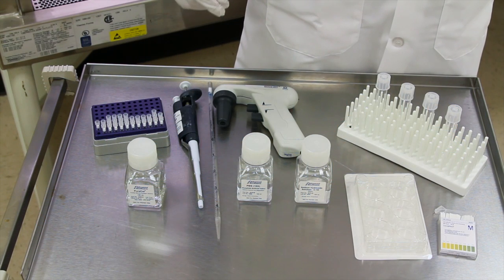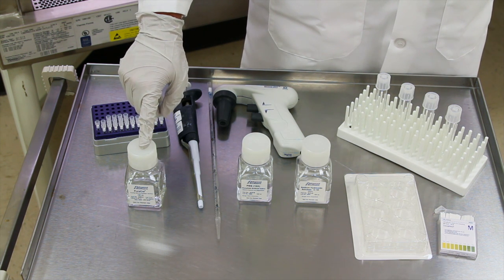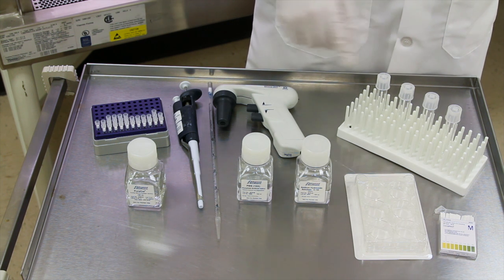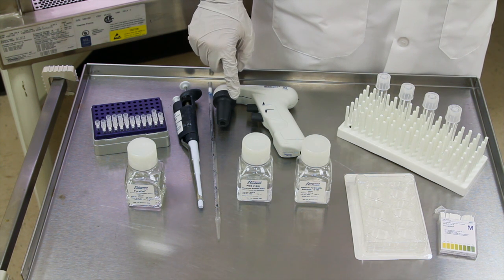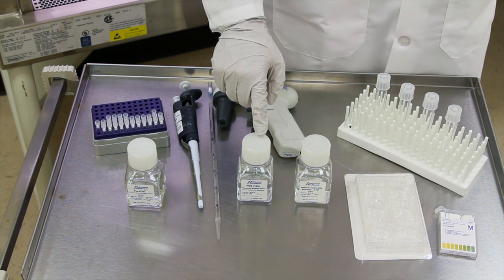You will need the following materials: purified collagen from Advanced Biomatrix, test tubes with caps and a holder, pipettes and dispensing tips, and 10x PBS Phosphate Buffered Saline or 10x Cell Culture Media.